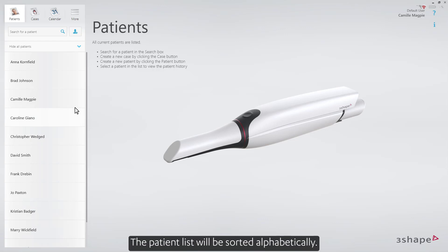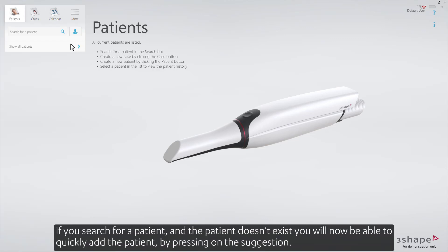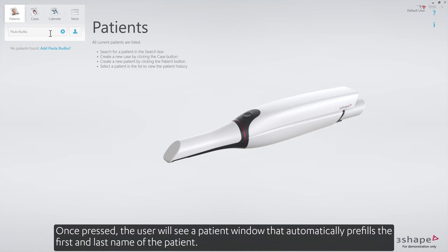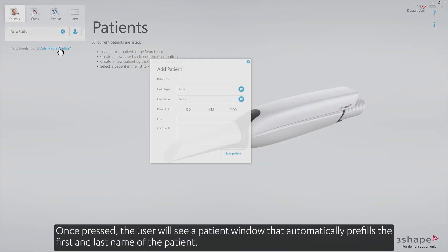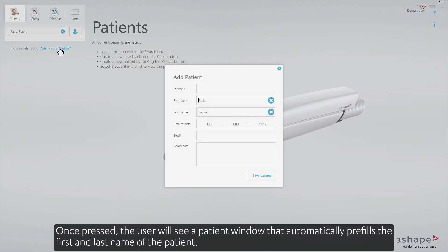The patient list will be sorted alphabetically. If you search for a patient and the patient doesn't exist, you will now be able to quickly add the patient by pressing on the suggestion. Once pressed, the user will see a patient window that automatically pre-fills the first and last name of the patient.